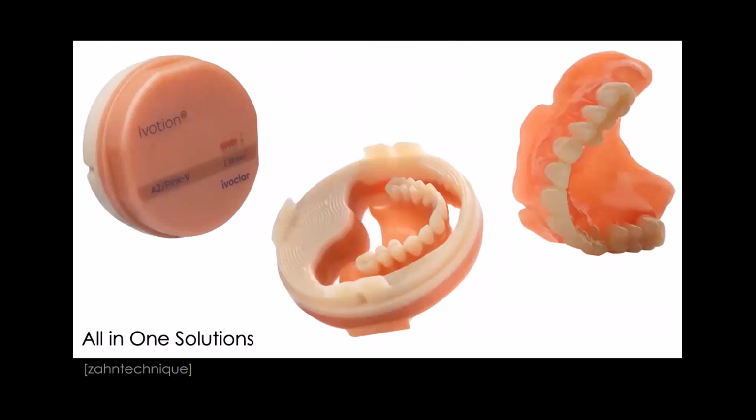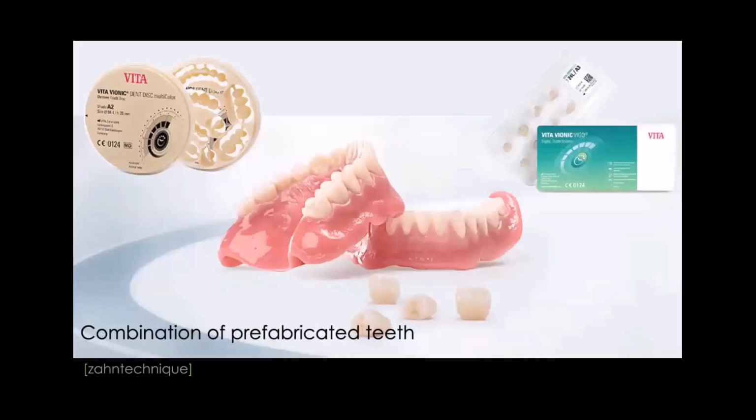But there are limitations. There are cases you cannot nest that denture properly into that blank. You will have some bleeding of either tooth colored into the pink or vice versa. So that's not a disaster. You just have to then manually later on remove these areas and then actually pretty much patch it with acrylic, right? To make it still nice aesthetic, which is not a problem because again, it's PMMA. PMMA is acrylic.